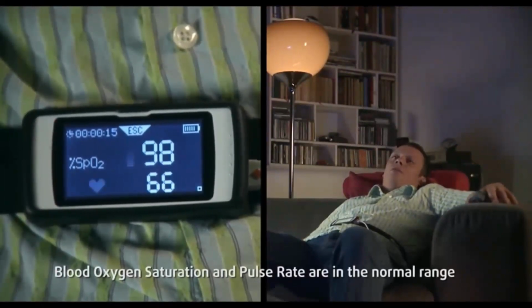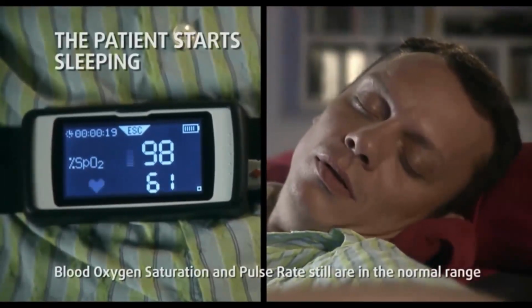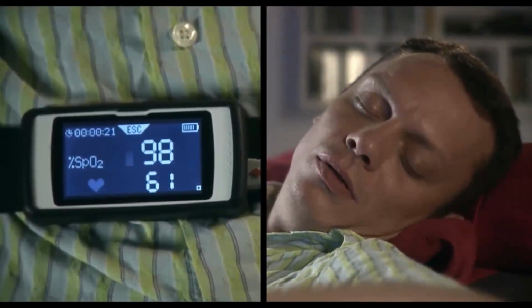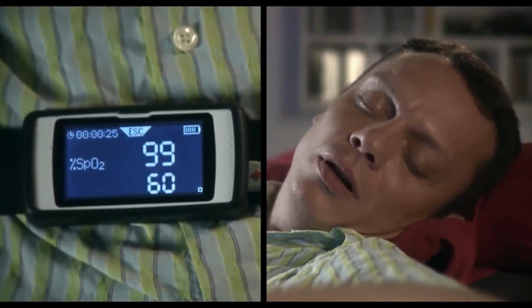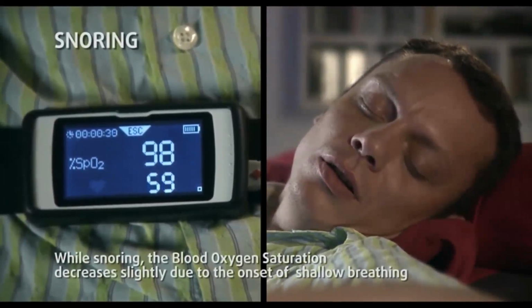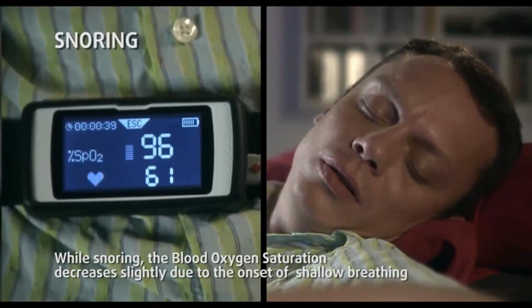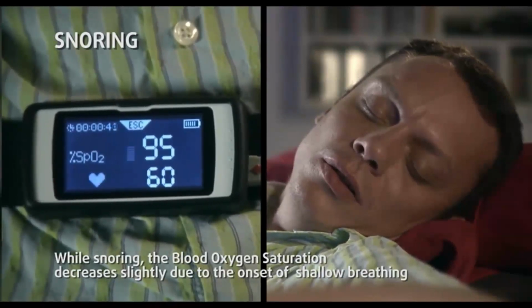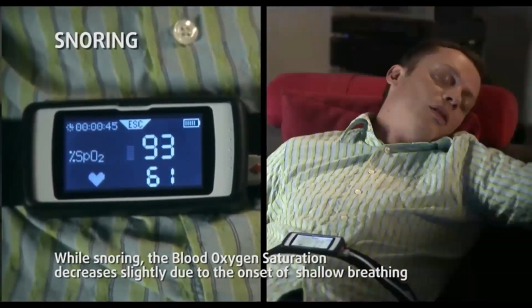And then as soon as the patient falls asleep, the apnea events, the snoring, there we go. We got some turbulent airflow. That's the back of the tongue falling back on the back of the airway. And even with snoring, you'll see the oxygen start to drop because it's turbulent airflow.